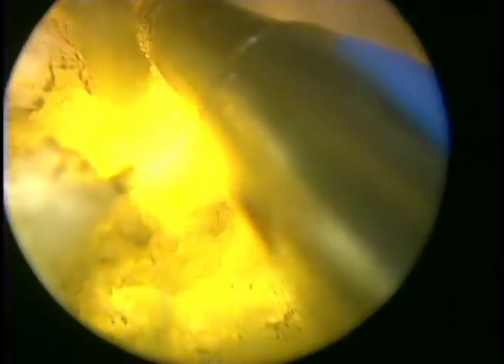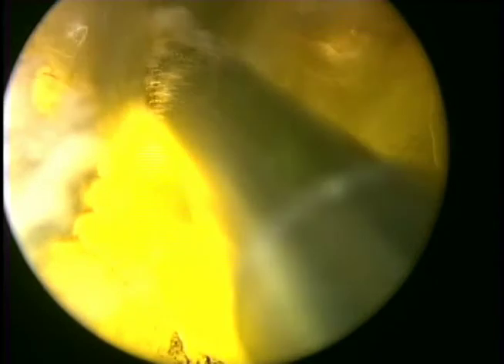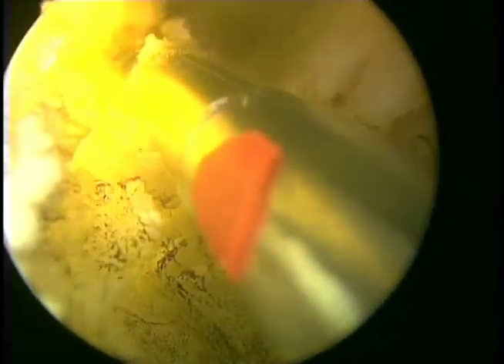In essence, this approach is very similar to the enucleation technique done by those using the holmium laser. It has excellent outcomes. However, with the holmium, it requires a secondary procedure and secondary equipment for true morcellation. So although this is a similar approach to a HoLEP, or the enucleation of the prostate, it is simply the enucleative properties and principles that we strive to achieve.